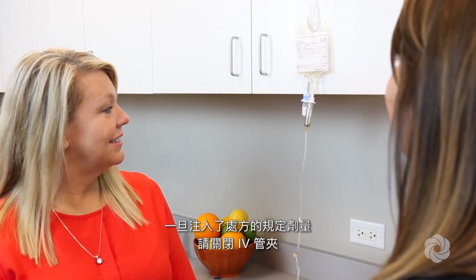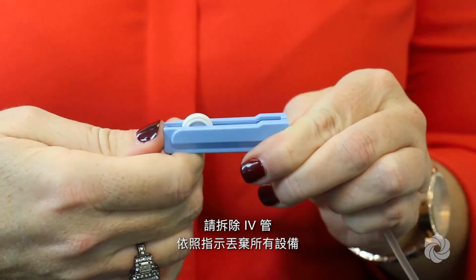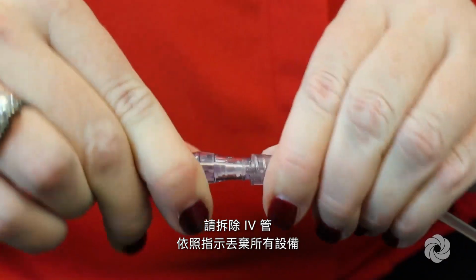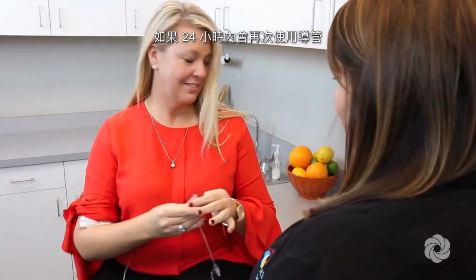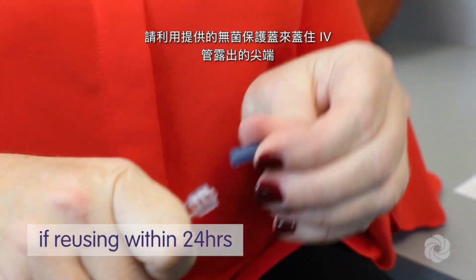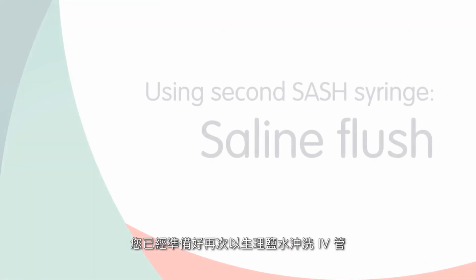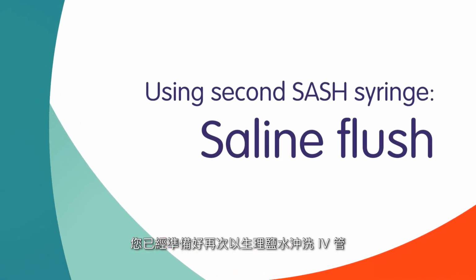Once the prescribed dose has infused, close the clamp on the IV tubing. Disconnect the IV tubing and discard all equipment as instructed. If the tubing is to be used again within 24 hours, cover the exposed IV tubing tip with a sterile cap provided. You are now ready to flush your IV line with saline again.